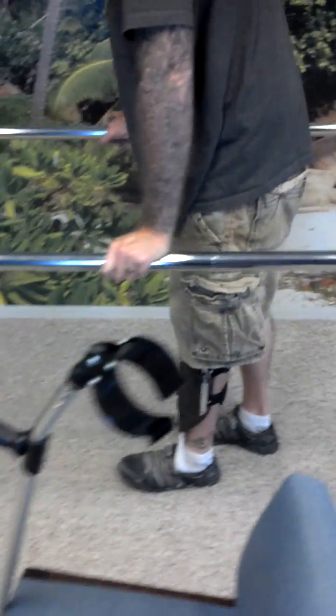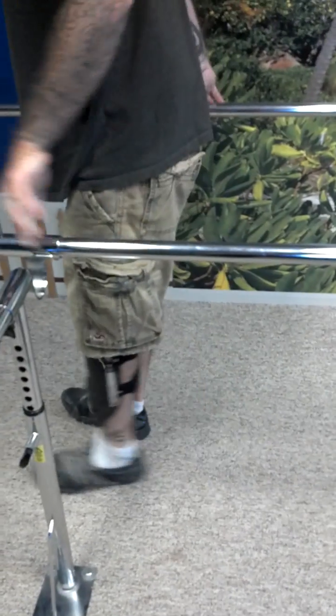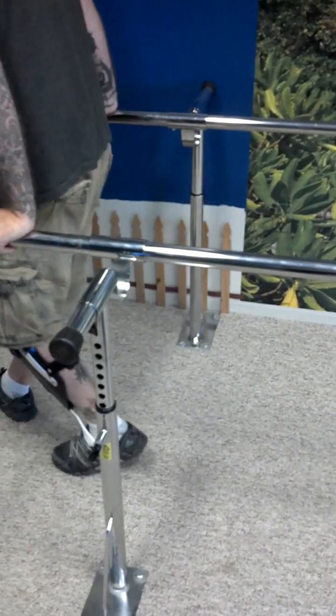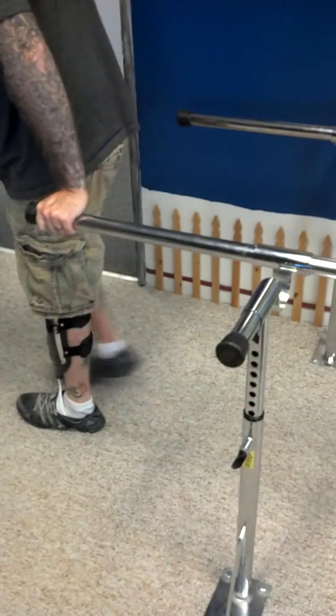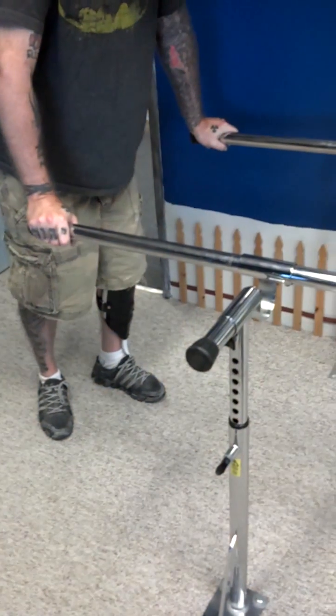Use that toe plate to kind of fire off those hips and then let that knee just swing that leg through. Yep. Do you feel any rubbing or pressure or anything like that? Yeah.